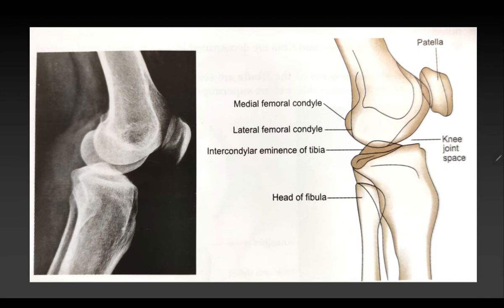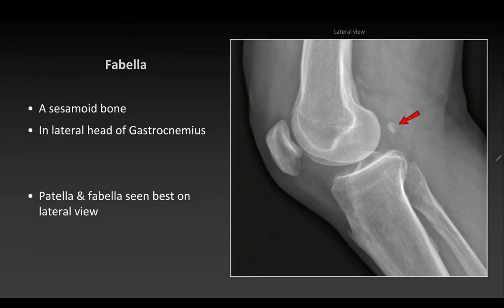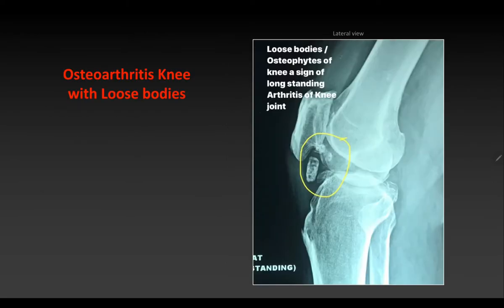On the lateral view you can see the patella, medial femoral condyle, lateral femoral condyle, tibia, tibial tuberosity, and head of fibula. Two sesamoid bones may be present: the patella and sometimes the fabella in the lateral head of gastrocnemius, present posteriorly. It is important to differentiate the fabella from loose bodies — if you see a bone lying in that region, it could be the fabella rather than a loose body.